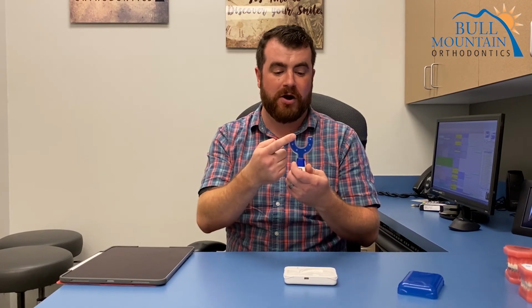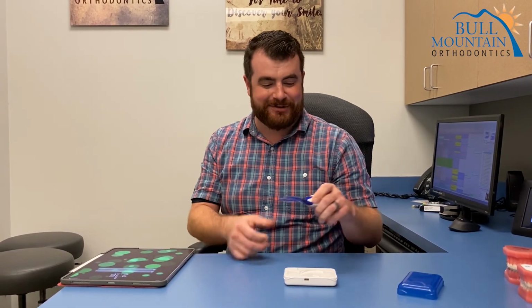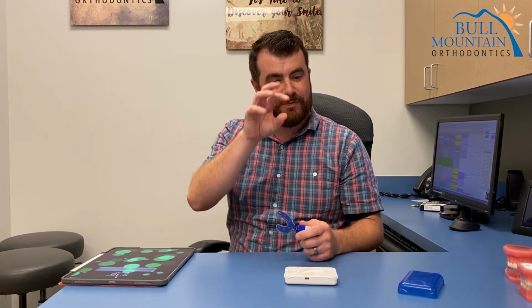If you find that your jaw's getting tired, you're biting too hard. If you're marking the mouthpiece, you're biting too hard. If your eyes feel weird, or you have headaches, you're biting too hard. So that's the last thing I'd like to remind you guys, is just be gentle with your bite. Just bite it so you can feel that it's vibrating inside your teeth and not trying to vibrate your whole head.